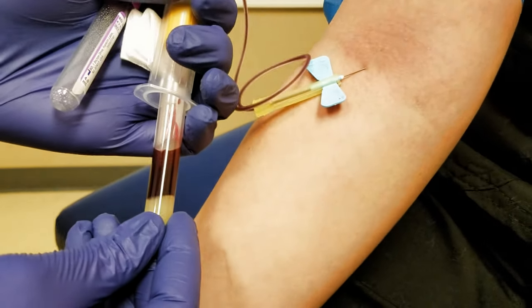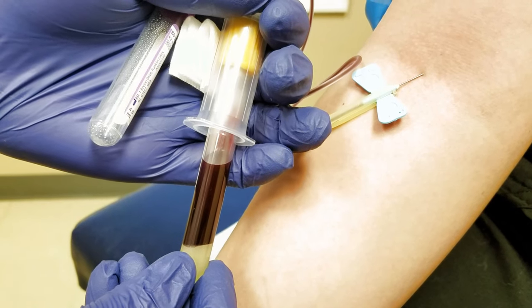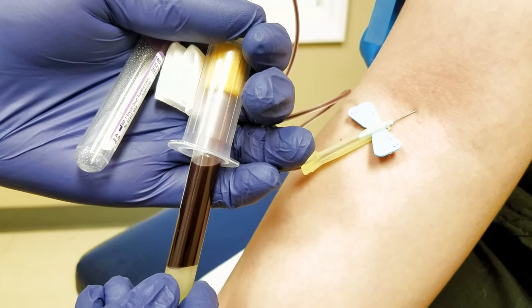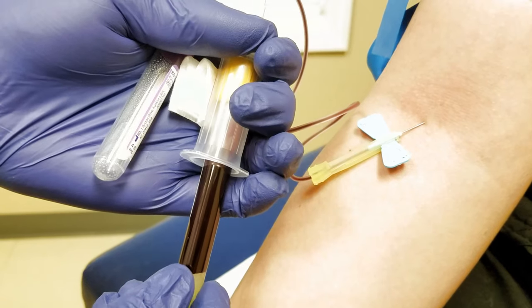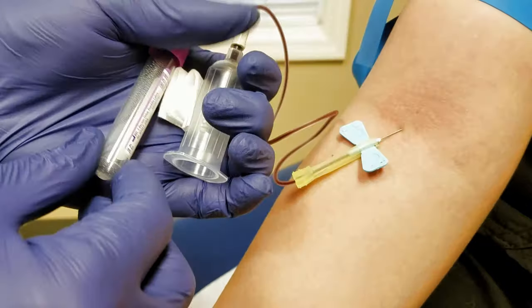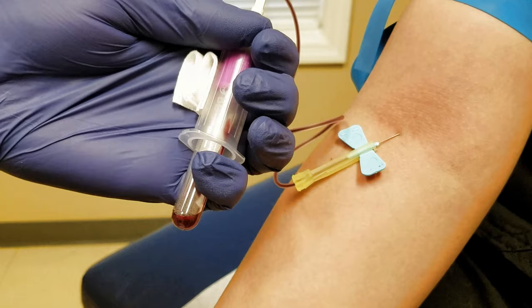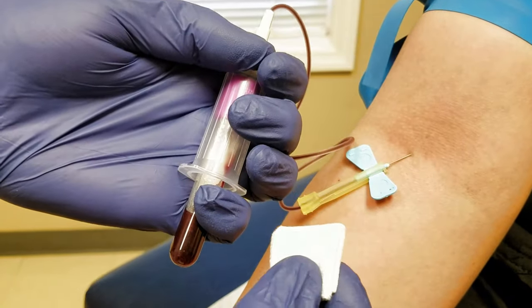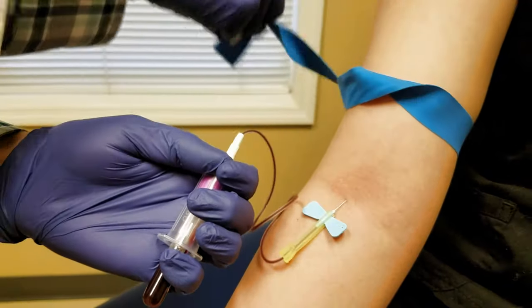As the blood gets up a little bit further, the flow is going to start to slow down. You can see it's slowing now — it's pretty full. So we're going to take it off, and the vacuum is going to keep the blood from dripping out. Take the last tube and put it in there — just pop it in — and it starts to flow too. About the time it's getting close to full, we're going to release the tourniquet. Go ahead and pop it off.